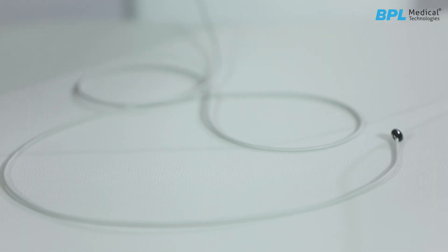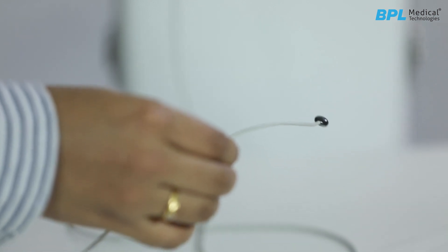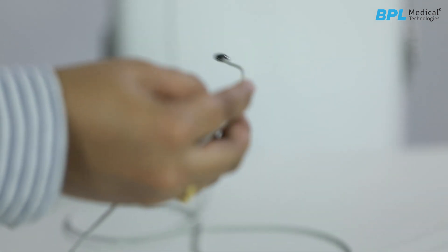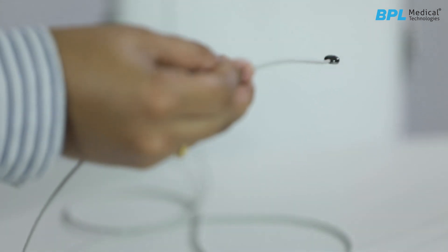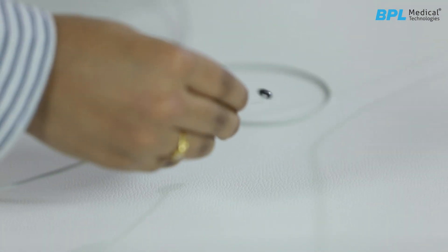The Fluorate 1000 baby warmer uses a thermistor temperature sensor to monitor the baby's temperature. It is recommended to keep the temperature sensor on top of the baby rather than placing it beneath the baby.